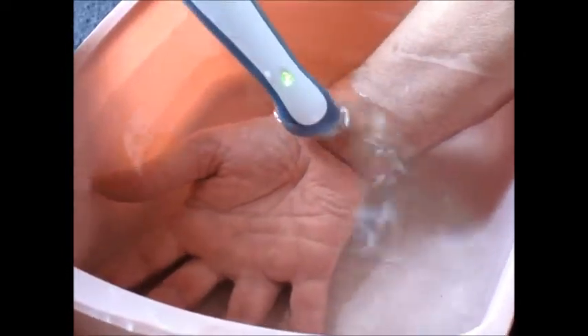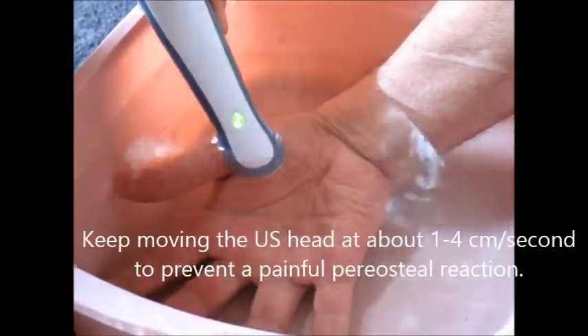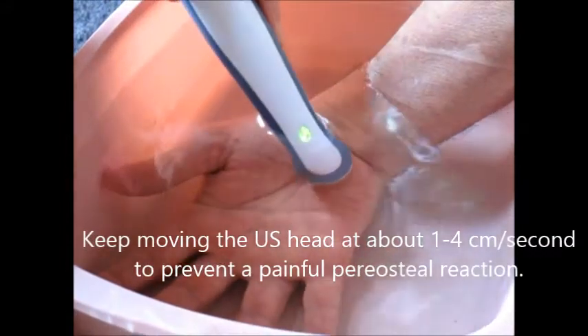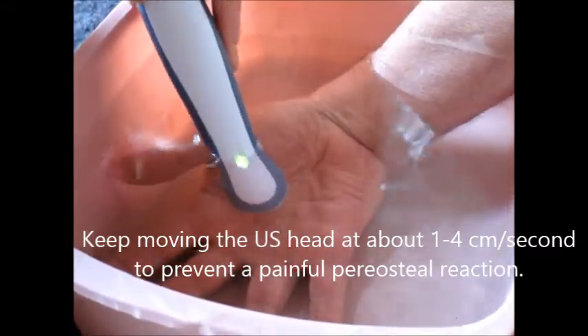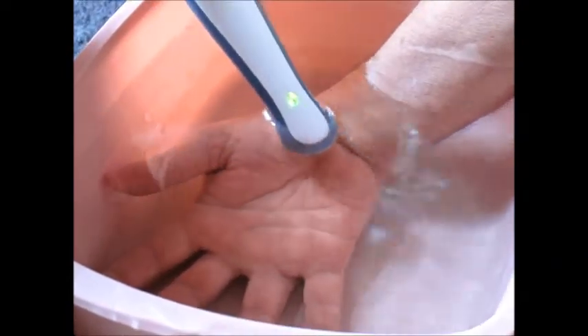You can see how fast I'm doing this. If I was working on his thenar pad, I would want to keep moving. If you stay in any one spot, you risk the bone hurting from the ultrasound hitting the area too long. It vibrates the bone and causes the periosteum to hurt — that's called a periosteal reaction.